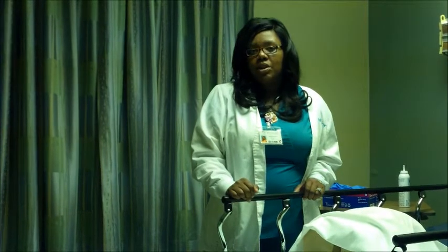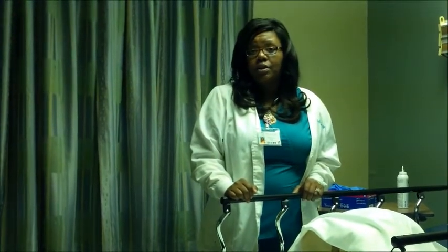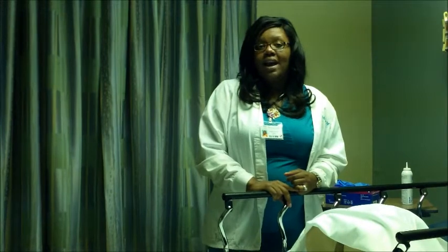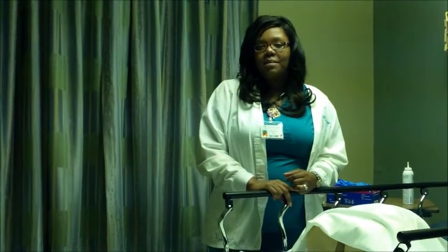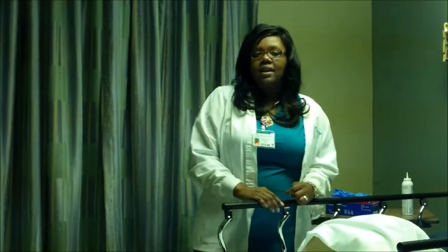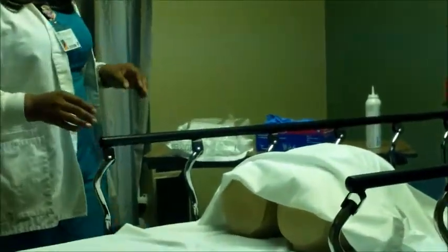I am here to do a teaching strategy on a demonstration of a urinary Foley catheter on a male patient. In a hospital setting, you would first check your physician's orders for appropriate indication for a Foley catheter for the patient, as well as check the patient's name and identity to make sure you have the right patient. Afterwards, you want to make sure you have all your supplies at the bedside, and that your bed is at waist height. Now, we're going to get started.